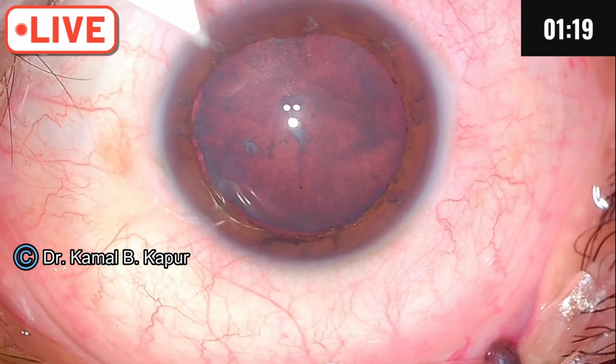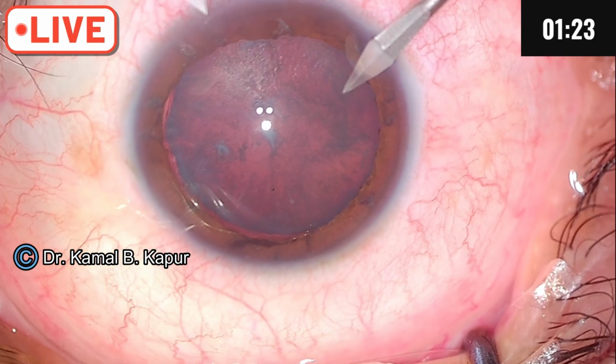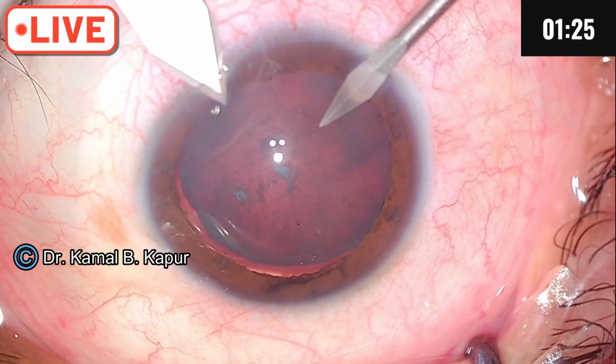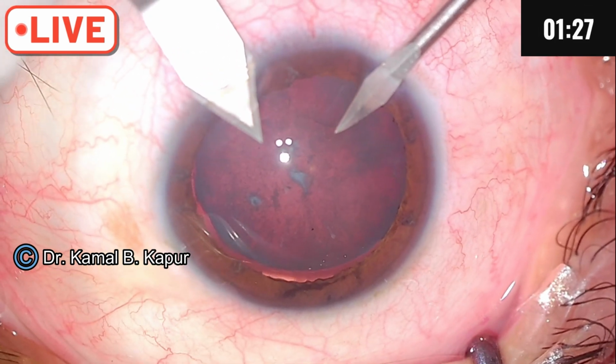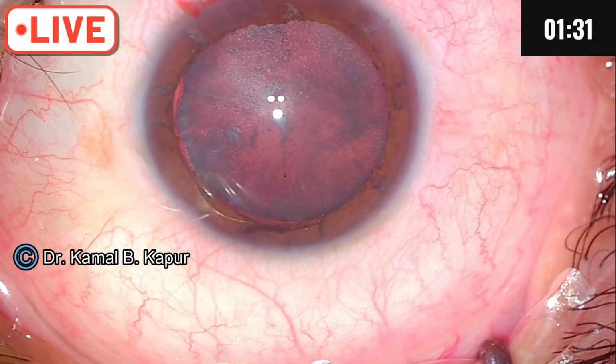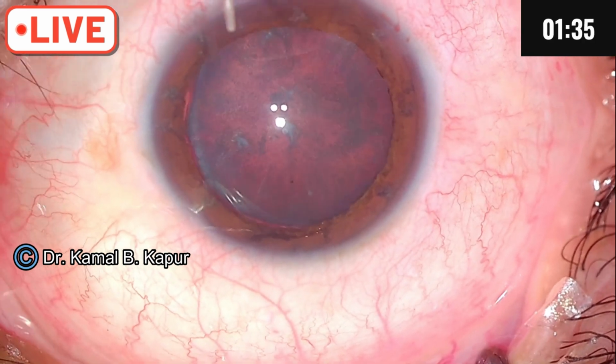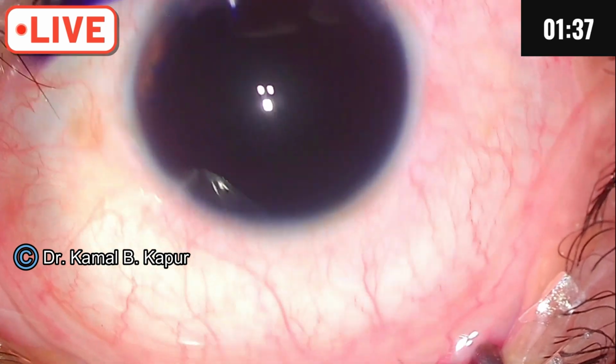Now we will make the ports a little longer because we don't want a leaky wound. So my incisions will be slightly longer than normal. There you are, slightly longer wounds. Even though I have a good glow here, I would want to stain.